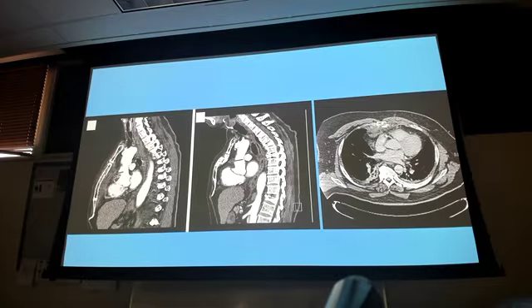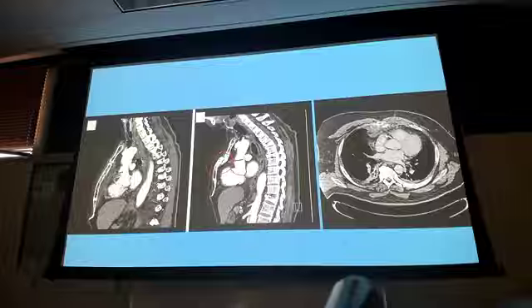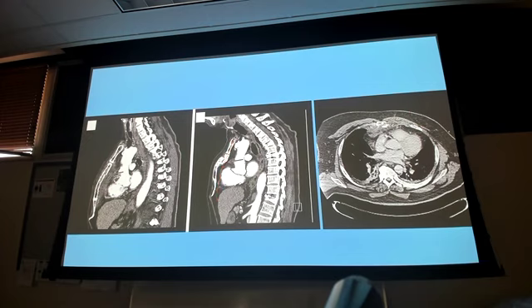What do we think? I don't like the color of it. It's just how the image came. What do we think the darkish gray arrow is pointing to? Right, a sternal fracture. So let me circle it up here, even though it's a big arrow. There, right? My sternum should be coming straight down like this, but it doesn't. It shifts over. Okay? And then also, this one does come straight down.